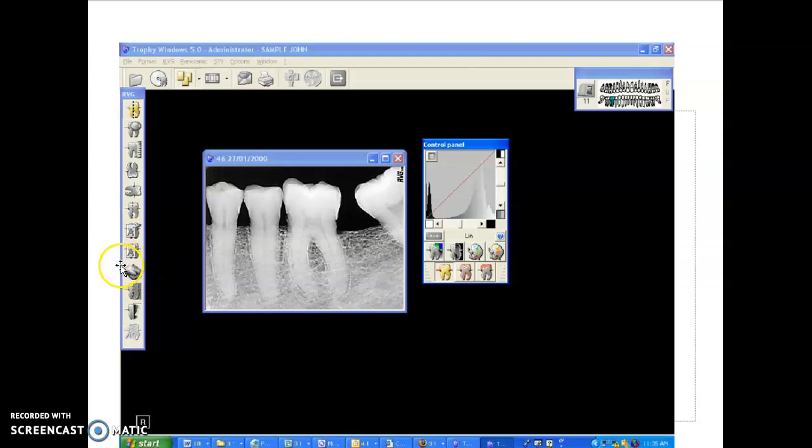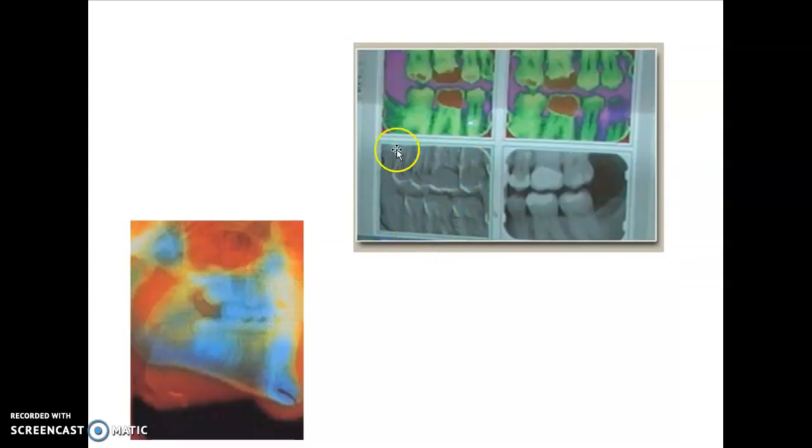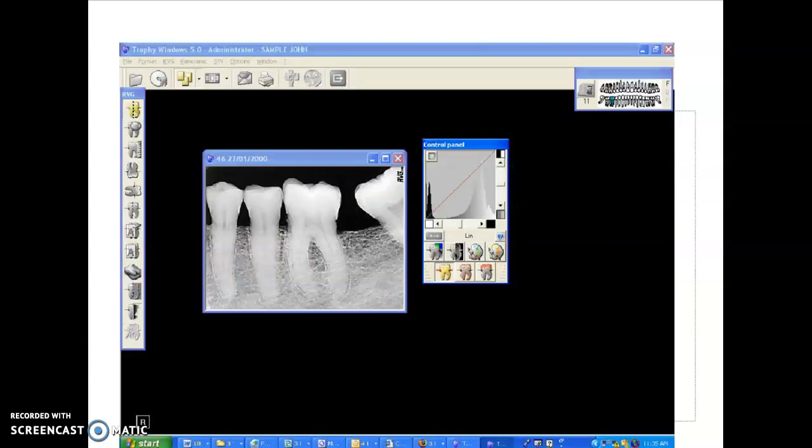This is the setting that, to me, the only way I know how to explain this is it looks like the little toys that you play with at Christmas, where it's a little box and you can put your hand through it, and it pushes little pins out the other side, but you can see the outline of your hand. That's what it looks like. It's the image that, let me go back and find that. It was this image. Again, I don't know what the purpose of that is. I've never seen anybody actually use it, but it's fun. Just something different way to look at things.